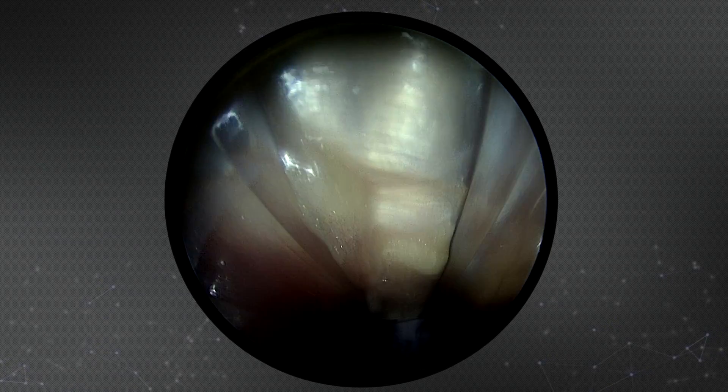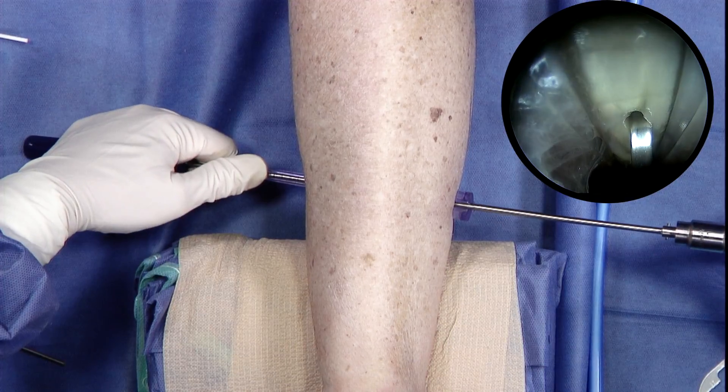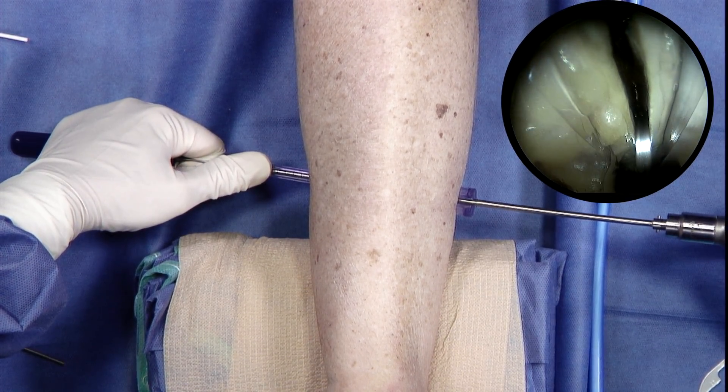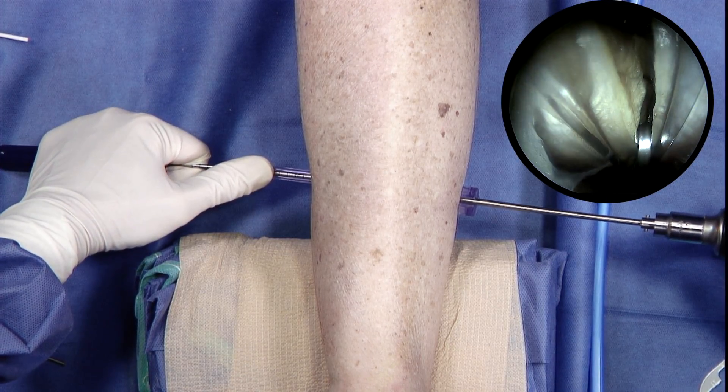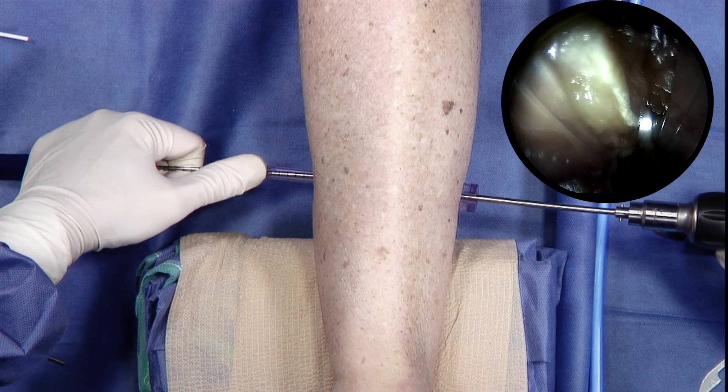I did a lot of arthroscopy as part of my sports medicine foot and ankle practice. When you do the same technique for many, many years, it's kind of hard to say there's a better way of doing it because you know how to do it and you know how to get it done quickly. But I can honestly say that doing it endoscopically, it's much safer and much quicker. The reason is that you visualize the whole fascia that you're releasing from medial to lateral — you're not trying to use retractors to see the lateral part of the fascia. You don't have to dissect out the sural nerve because you can actually visualize it. The arthroscope lets you see much further and much better over a much longer distance than using an incision. I switched over and I think it's better, even though I thought I had kind of perfected the open technique.